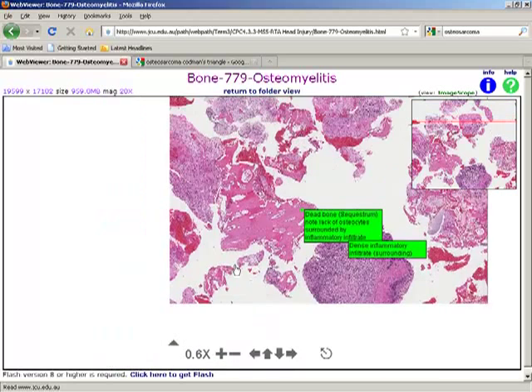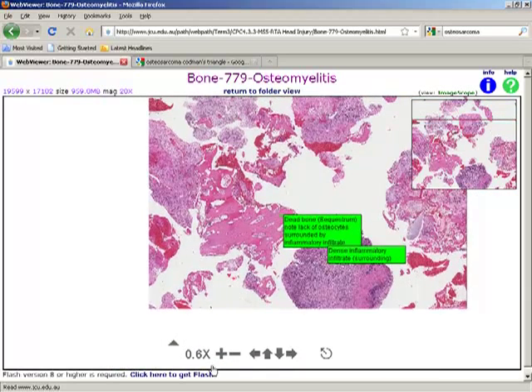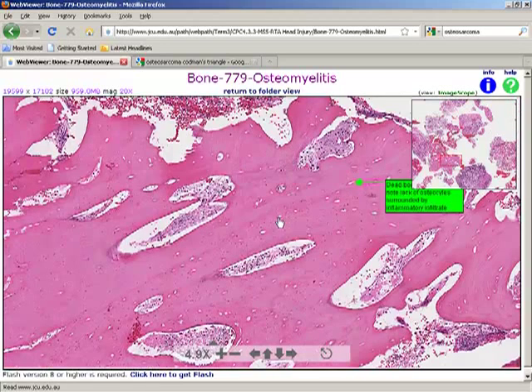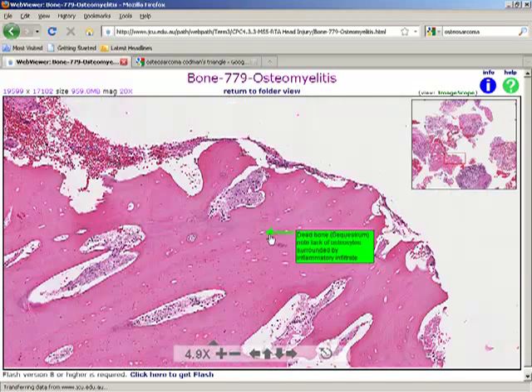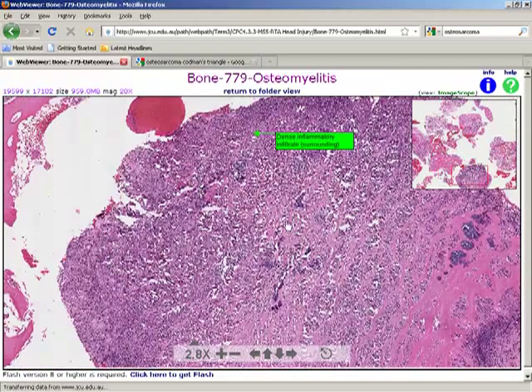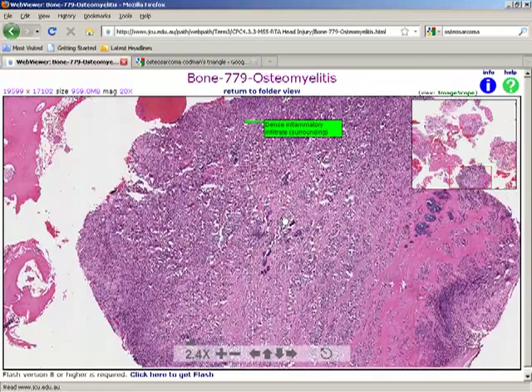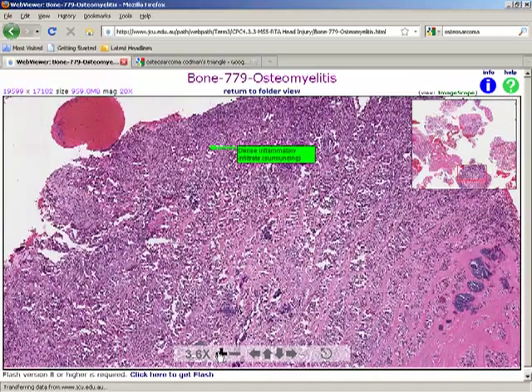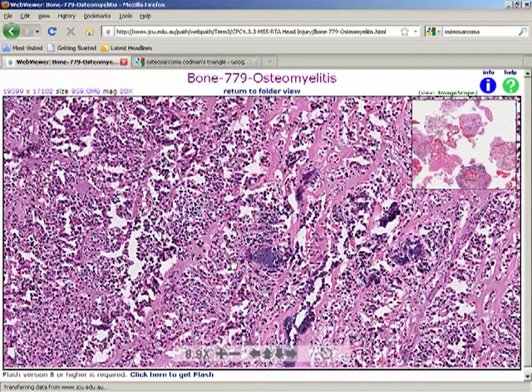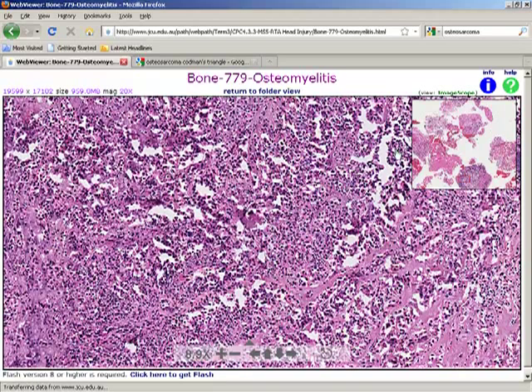Now, if it is an infection, osteomyelitis, here you would see dead bone. Dead bone is like mature bone, but the osteocytes missing in the canal. So, you will see dead spaces, means empty spaces, no nuclei. Okay, that's a dead piece of the bone surrounded by plenty of inflammatory cells. And this collection of inflammatory cells in focal areas are nothing but abscesses. So, you will see plenty of inflammatory cells forming abscess with dead bone. That would be osteomyelitis.